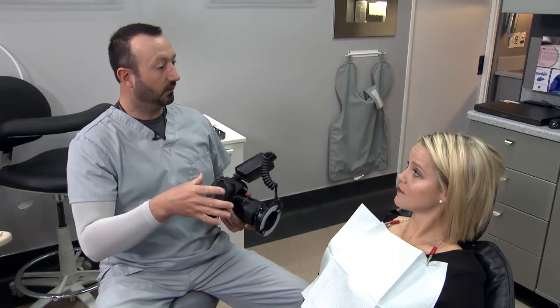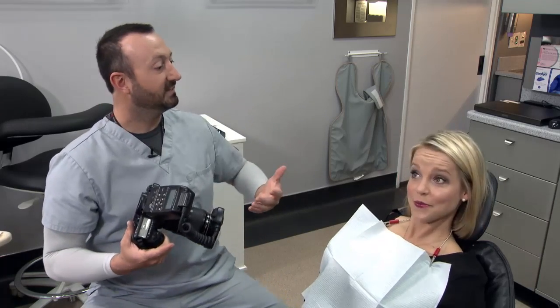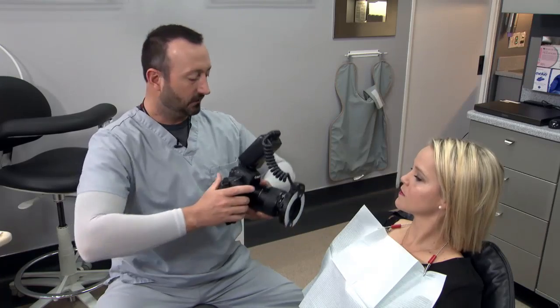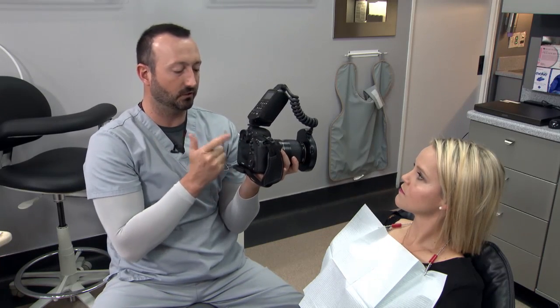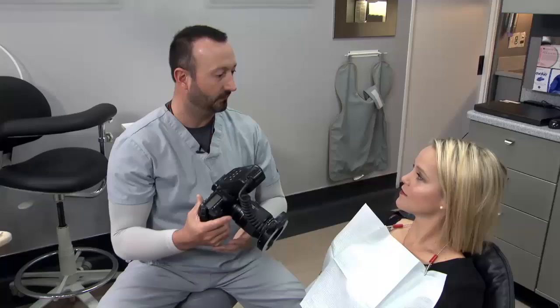The very first thing I want to do is take a few smile shots. I don't like to have the operatory light directly on the patient's mouth — instead I use my ring flash to get the proper shots. The first shot is just a nice natural smile. To keep your camera steady, instead of holding your arms out like wings, tuck them into your chest, bring your body in, and have a nice strong base. I refrain from using the screen and instead use the viewfinder. My next shot is taken from an angle centering the canine in the shot, and I like to sit down so I'm at eye level with the patient rather than standing and leaning over.